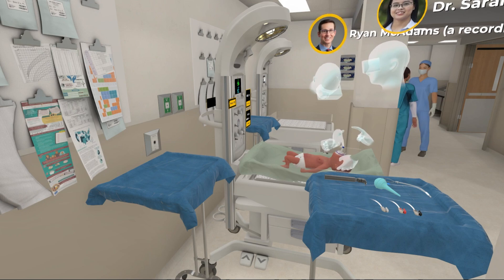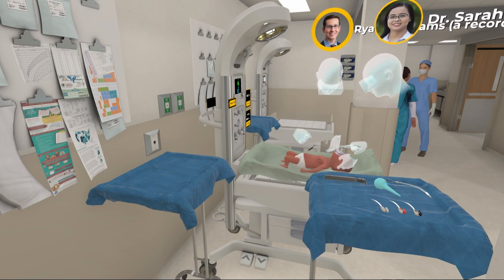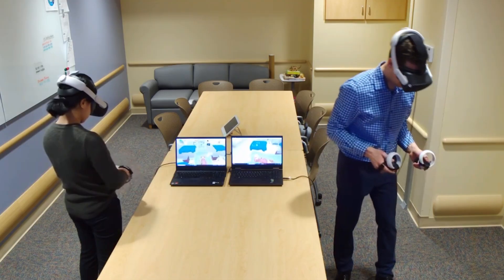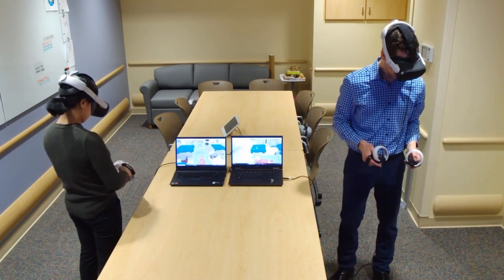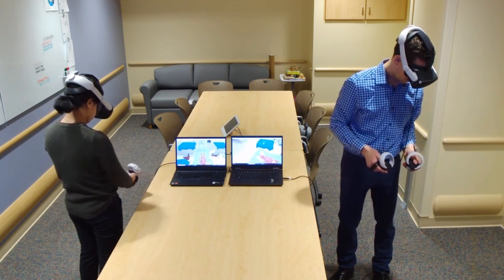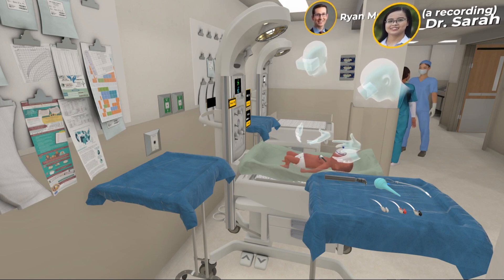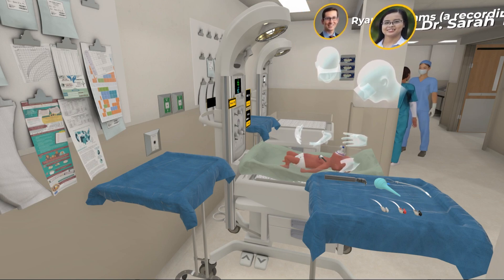I'm going to listen. I'm not really seeing any chest rise, and I'm not hearing good air movement either. I think we should go through the Mr. SOAP steps. I'll go through the first two steps with mask adjustment and positioning. I'm in the sniffing position. Clear the airway. Good mask seal.